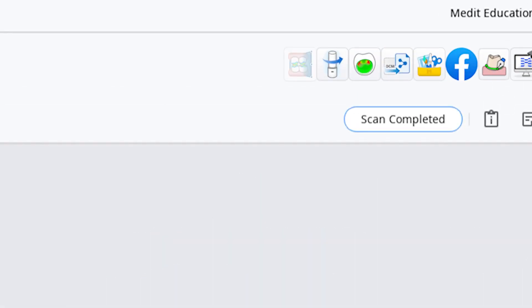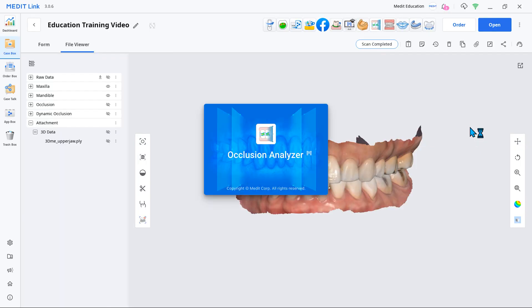Now you can quickly realign data and perform occlusion analysis without the bother of reprocessing your entire scan data.